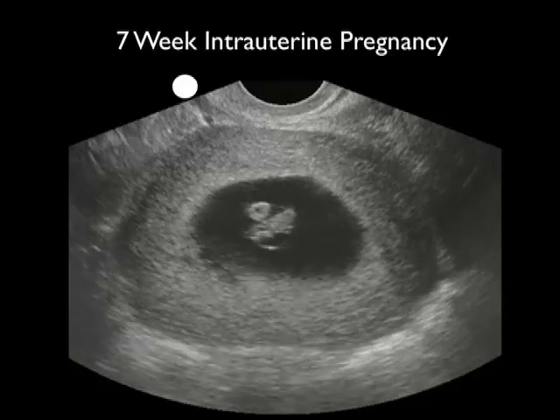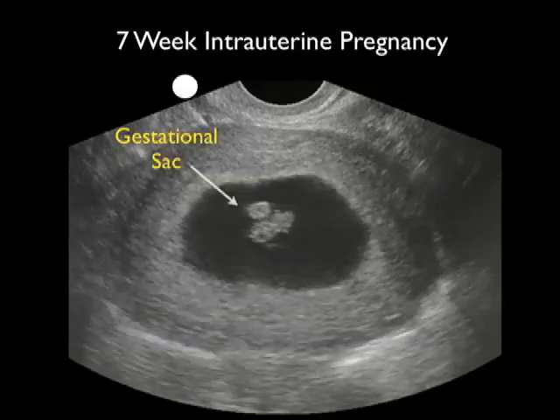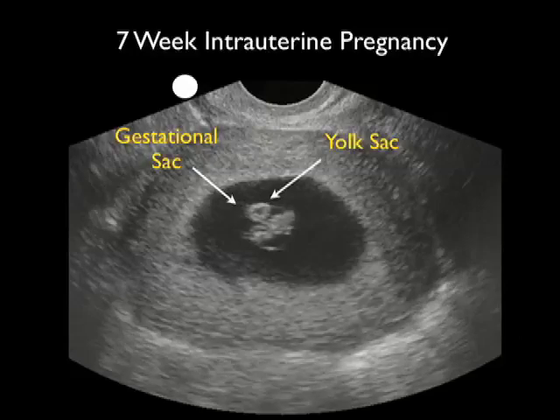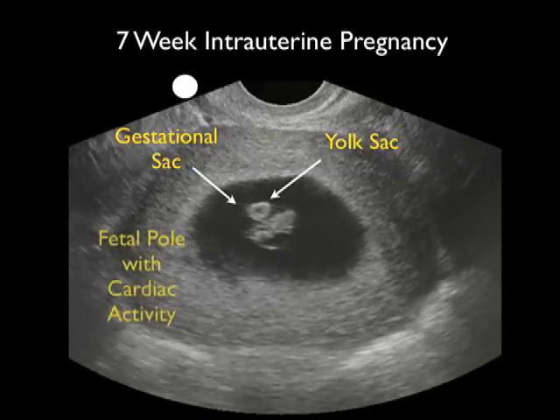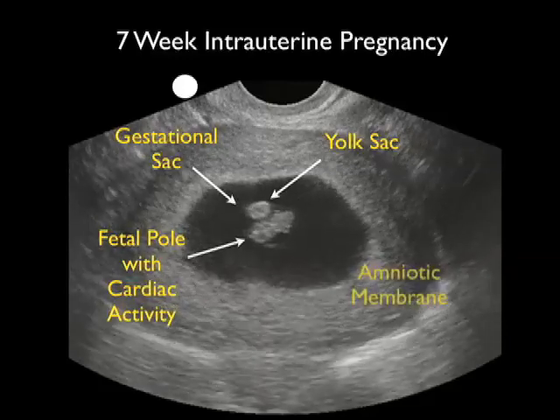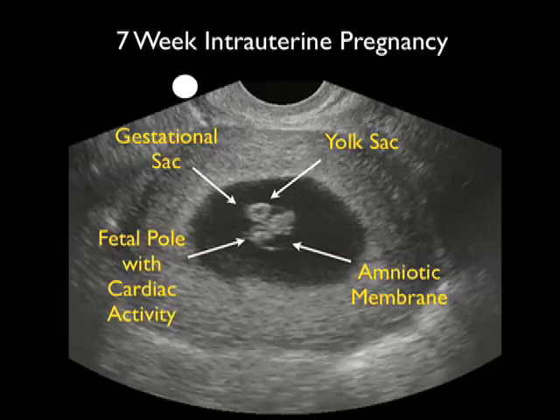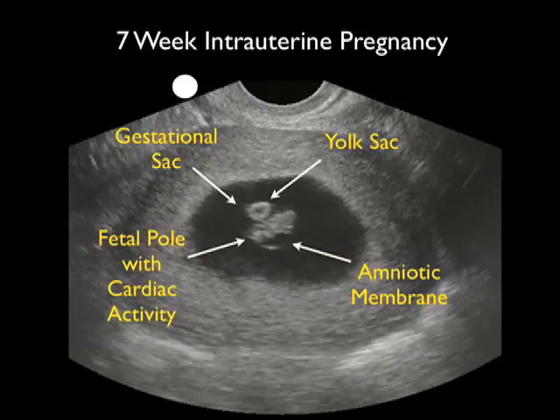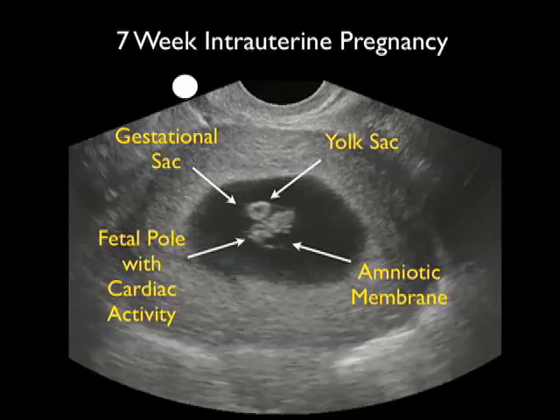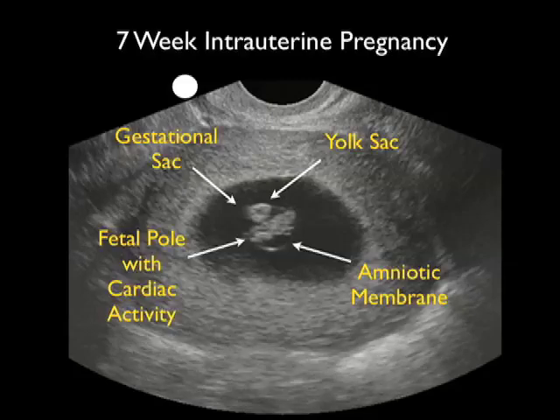Here's another intrauterine pregnancy at about 7 weeks, again in the transvaginal short axis view. Note the good amount of uterus surrounding the gestational sac, signifying the fundal location. We see the yolk sac, or cheerio sign, and the fetal pole stretched out below it, with positive cardiac activity. We also see another very important finding: the amniotic membrane billowing out from around the fetal pole. Eventually, the amniotic membrane will plaster down on the margins of the gestational sac to form the amniotic cavity, in which further fetal growth will occur.